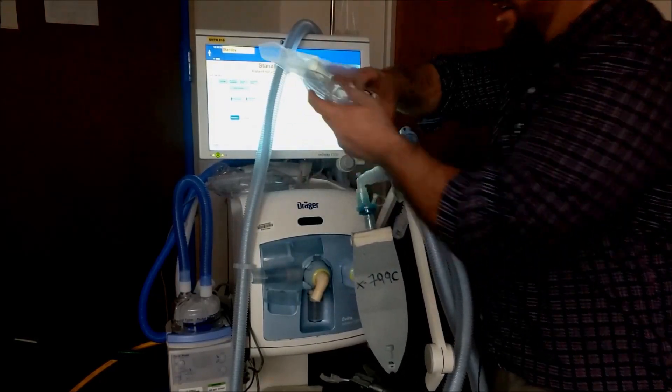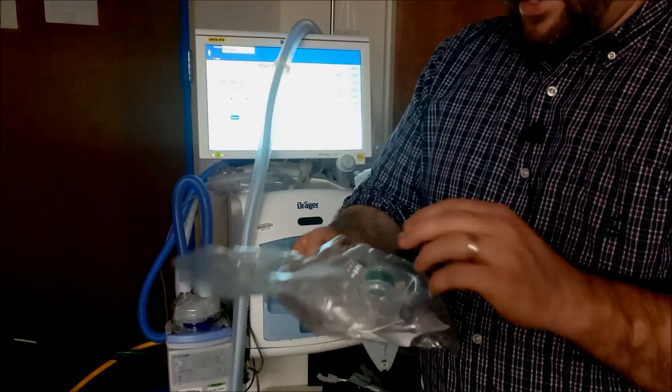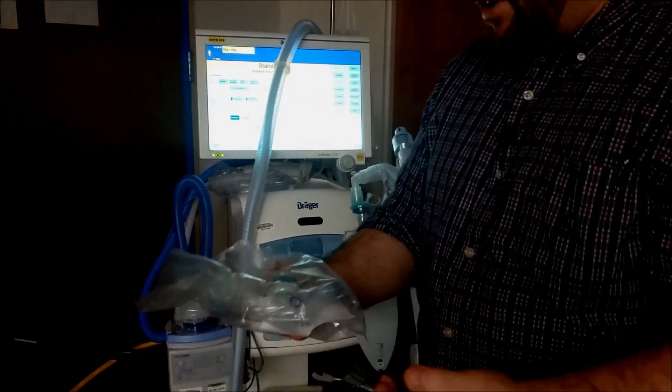The next thing you need are two nebulizer setups. Ours are from Salter. Of the nebulizer setup, all you're going to take out is the T — the clear T out of both nebulizer setups.